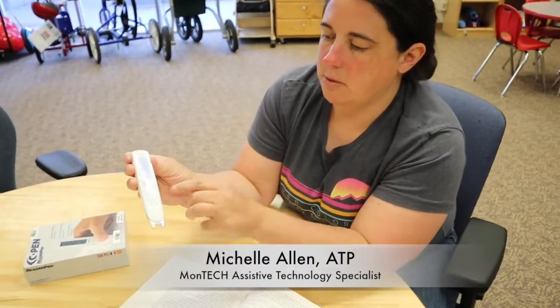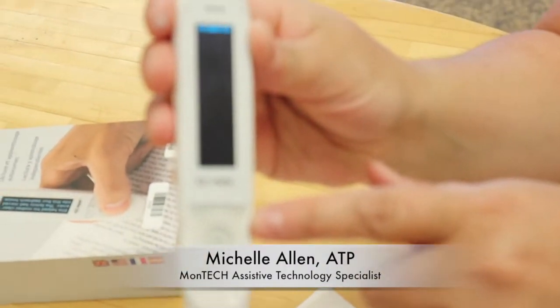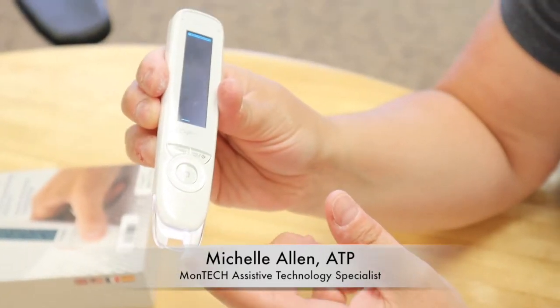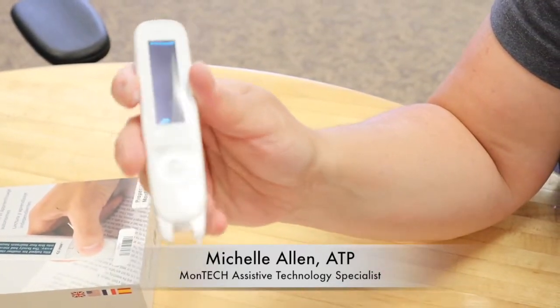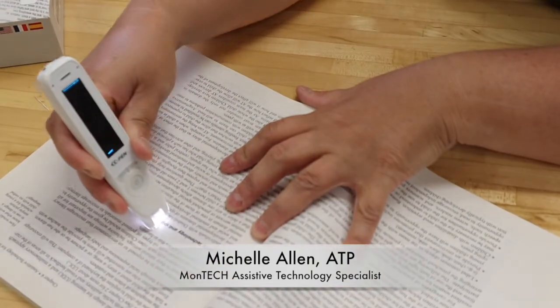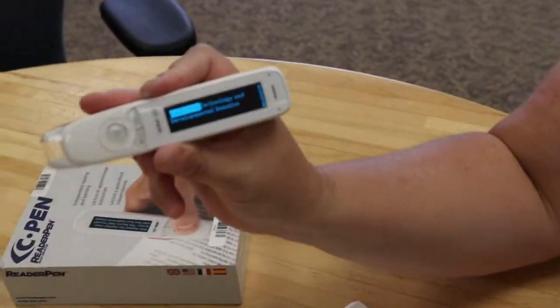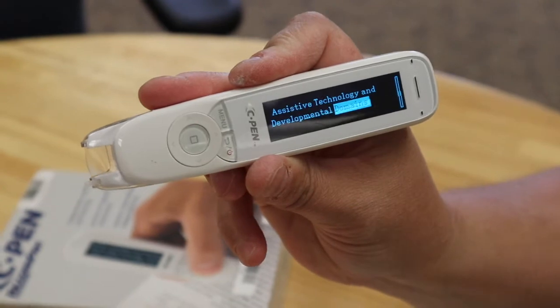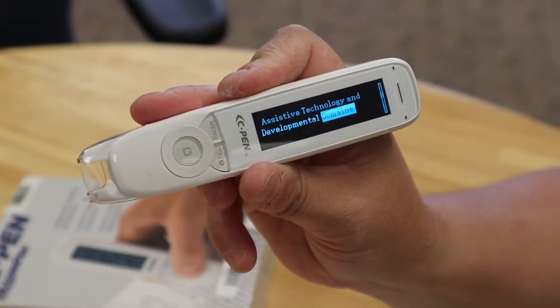The way this works is you would hit the power button to turn it on, and then it's ready to scan. When you push down here, a light comes on so you know it's scanning. So I'm going to scan this sentence here — it will scan the sentence and then read it aloud to you.